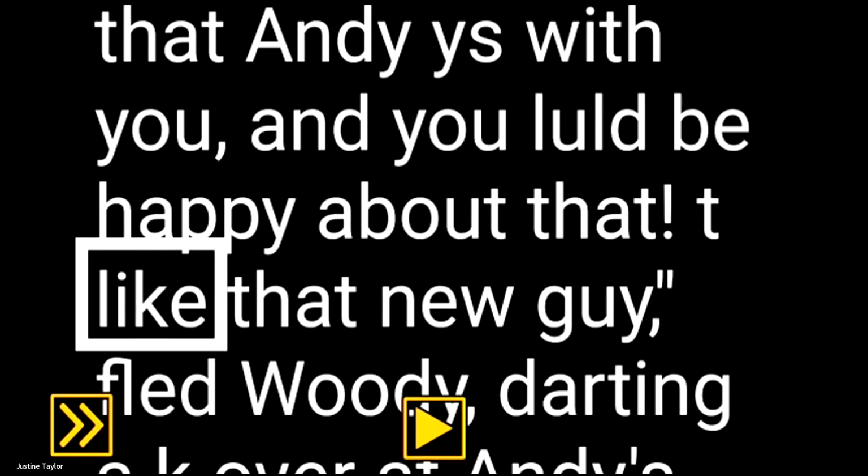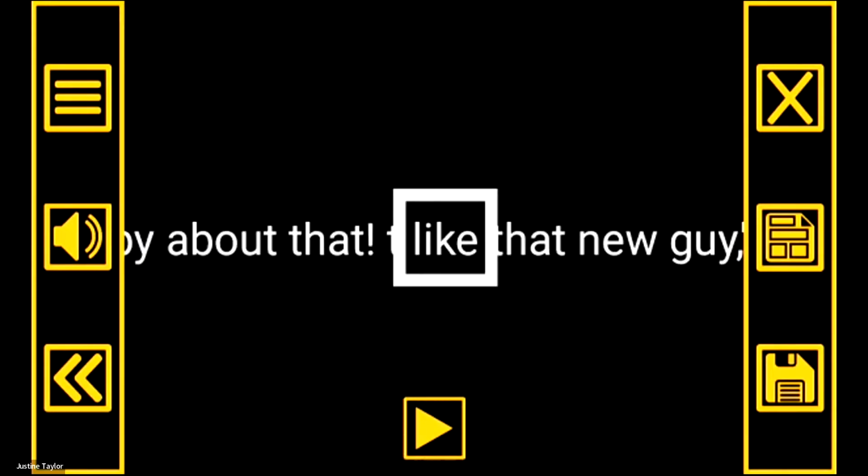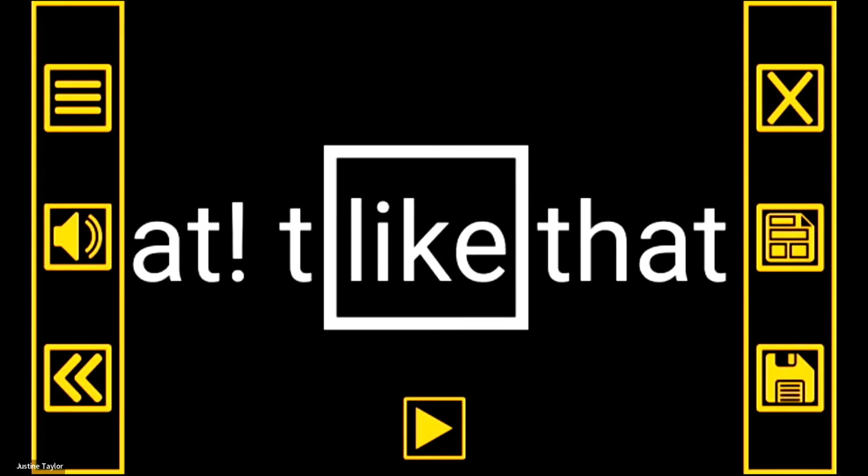But it's nice to be able to toggle. So this is the Restore button. If you want to change the view, the button in the middle on the right of the button bar tells you what view you're going to switch to. Change to ticker tape mode. So this is going to be the ticker tape, where you're just reading one line at a time.